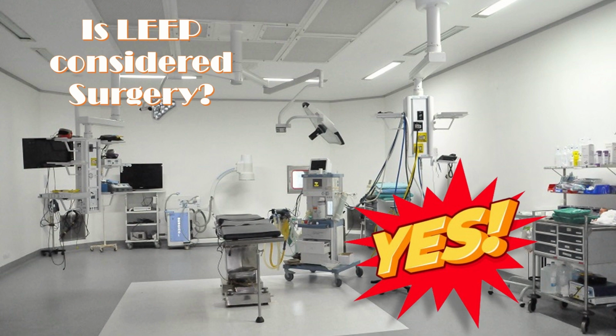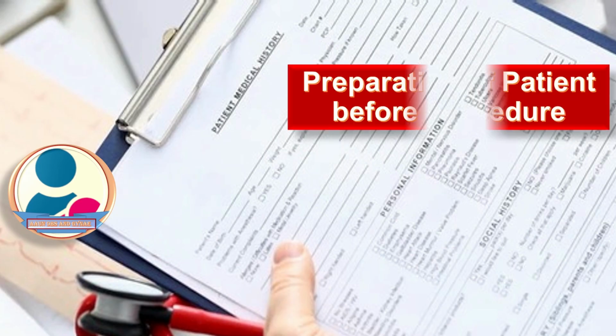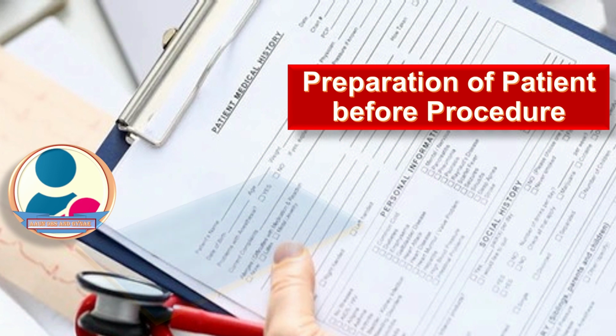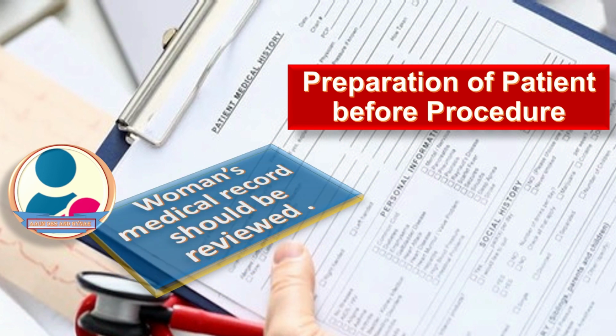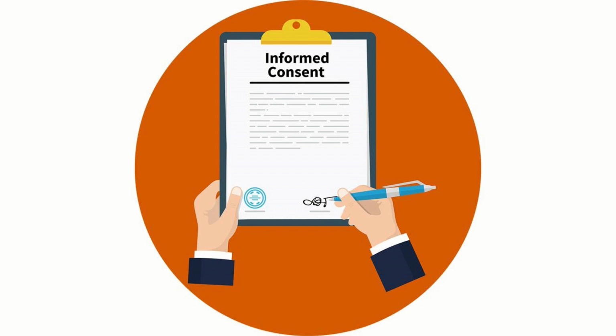Now we will explain the procedure of LEEP. The first very important step is the preparation of the patient before the procedure. Prior to examination, a woman's medical record, including the gynecologic and dysplasia history, should be reviewed to make sure that there is a legitimate indication for the procedure. Take well-informed consent from the patient along with explaining the whole procedure, its complications, its risks and indication.